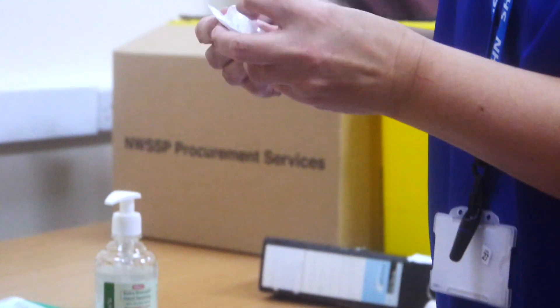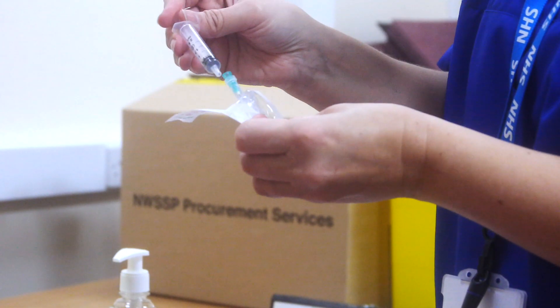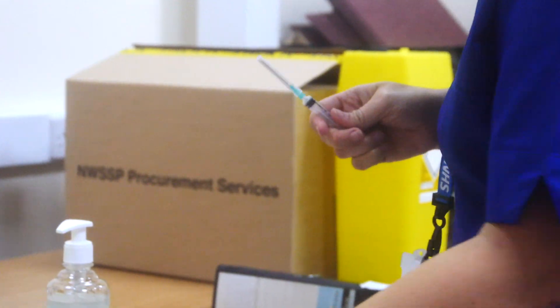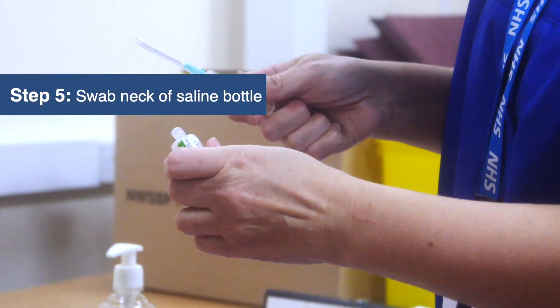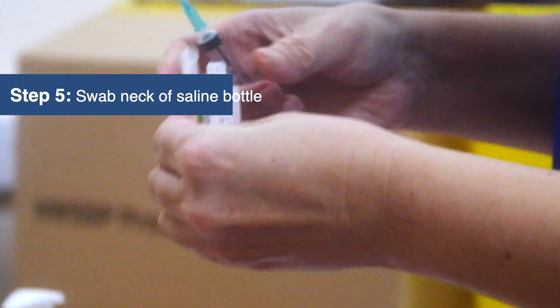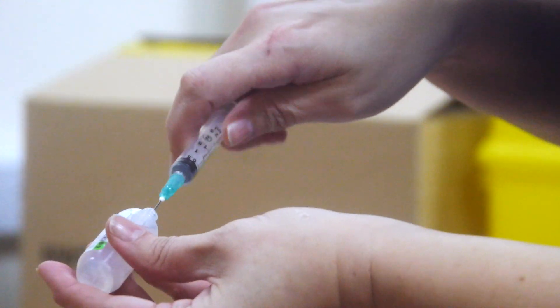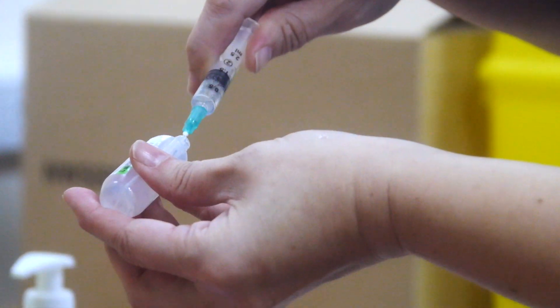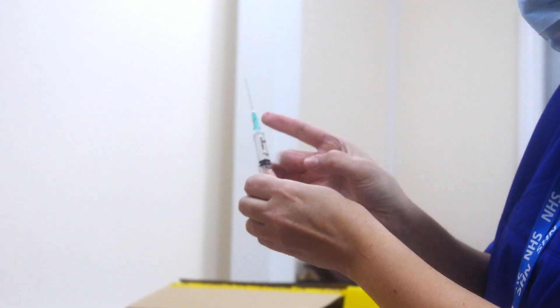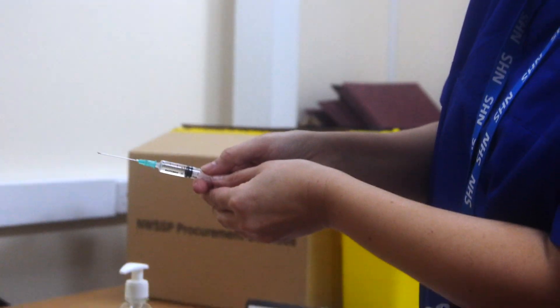You need to put together the 2ml syringe and the needle, then draw up 1.8ml of the saline from the solution that has been swabbed.